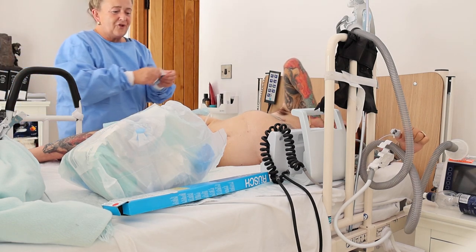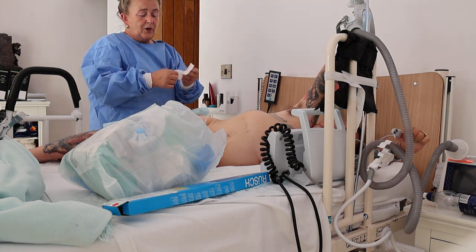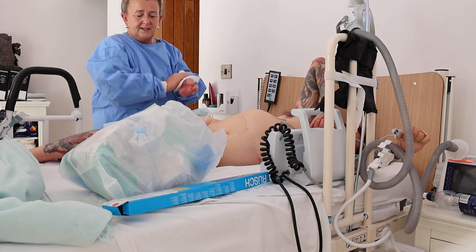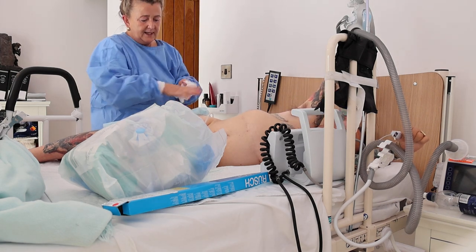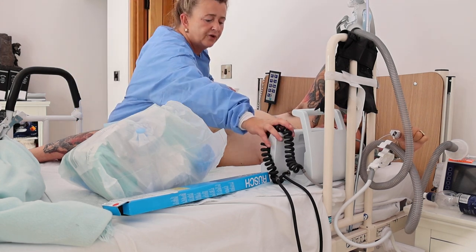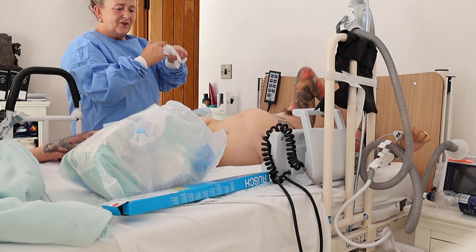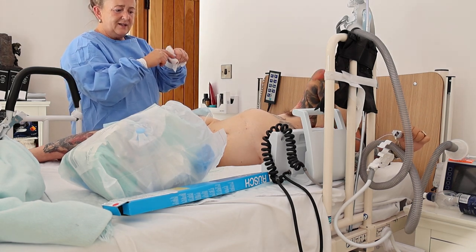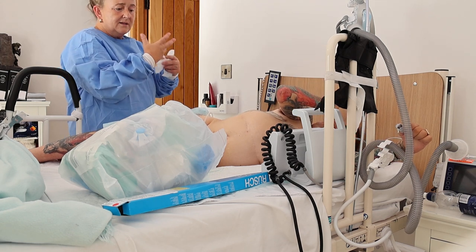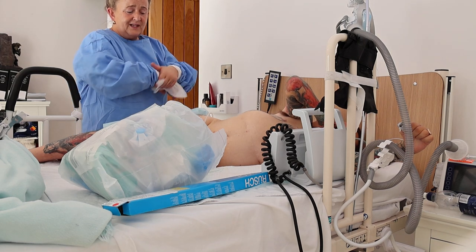I do all my 1, 2, 3 inspections. I'm just going to wash my hands and do one more reading. I know this is kind of a boring step-by-step guide, but I'm going to tell you now, it will get rid of the infection, because the tube itself, inside where it sits with the balloon, gets a build up, and I could smell that this morning without even having to do any of this.